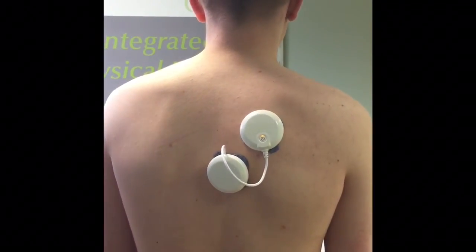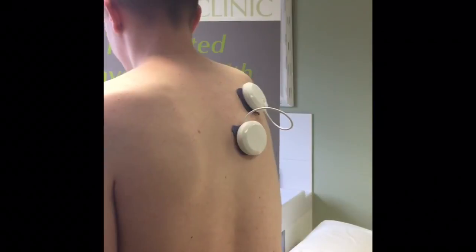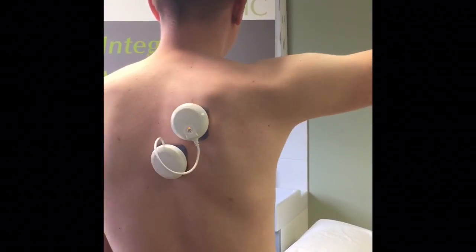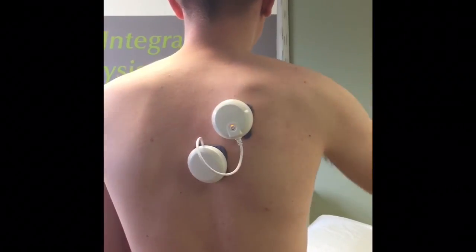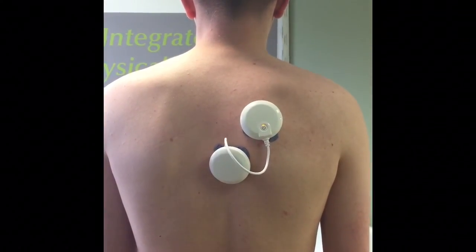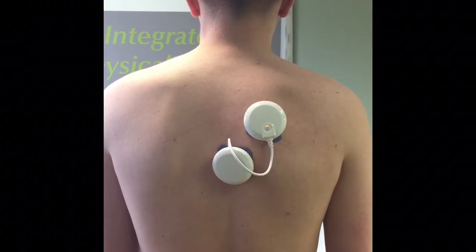Also, if Joe is playing his tennis strokes, when the machine contracts as it is now, we can use that to encourage his shoulder blade to come back into position to enable strong movement of the arm. Thank you so much.